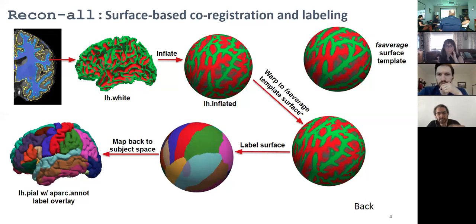And people do that. There are people that use FreeSurfer and people that use other tools that will come up with a study population template for doing the co-registration. Right, it's like DARTEL, for example, in SPM, where you have the whole DARTEL package to do group-specific normalization, where you create a template based on your specific group. That is fine as long as you don't bias it to one portion of the subgroup that you're trying to analyze. Oh, okay, that makes sense.